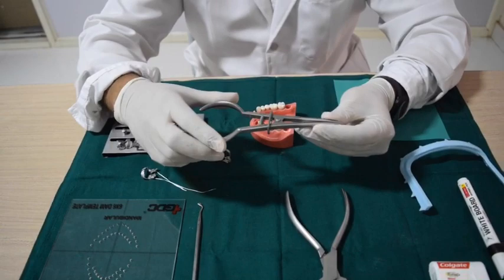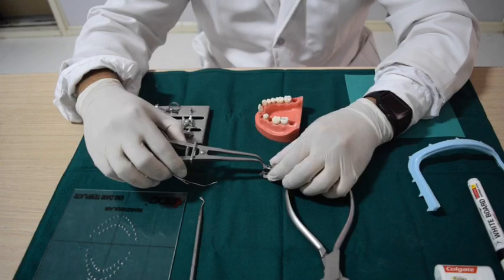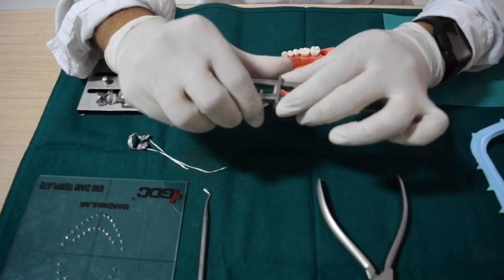This is called a rubber dam forceps. It has got two prongs which will hold the rubber dam clamp, and it has got an adjustable table where we can secure the clamp.